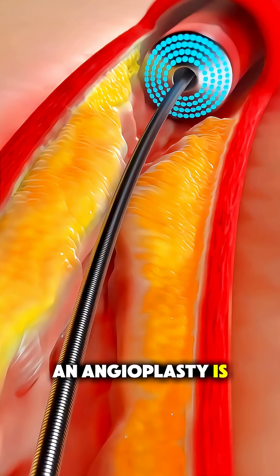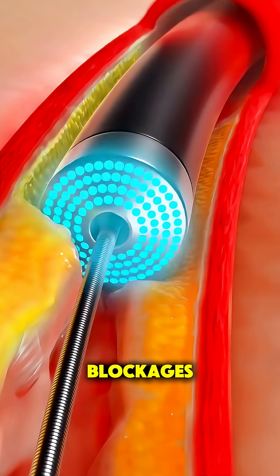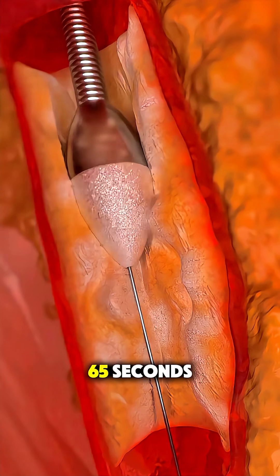Ever wonder how an atherectomy is done — the amazing procedure doctors use to clear out artery blockages and restore blood flow? Let's break it down in 65 seconds.